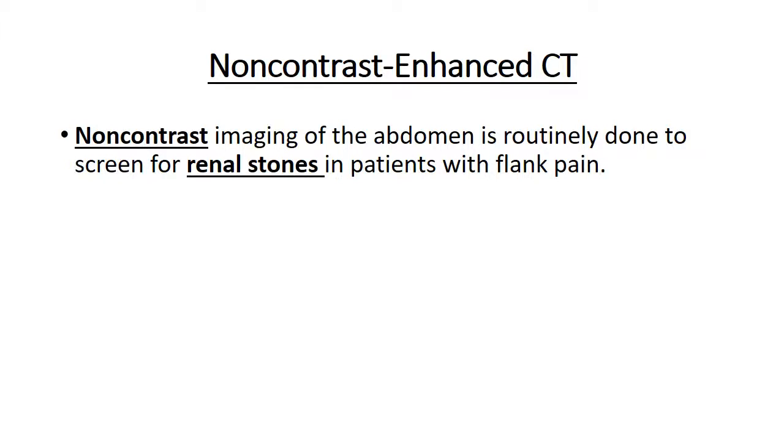Non-contrast enhanced CT is generally what we use for renal stones. Most institutions have something called a CT stone protocol, which you can order in that fashion. It comes with no contrast. There's no oral contrast. There's no IV contrast. Why is there no IV contrast?